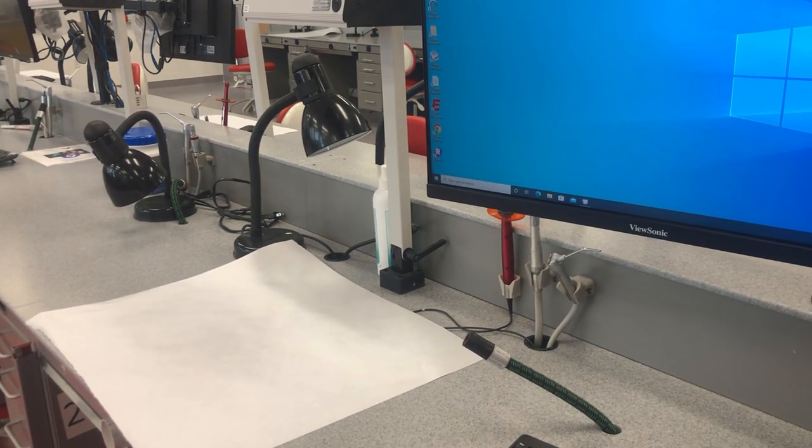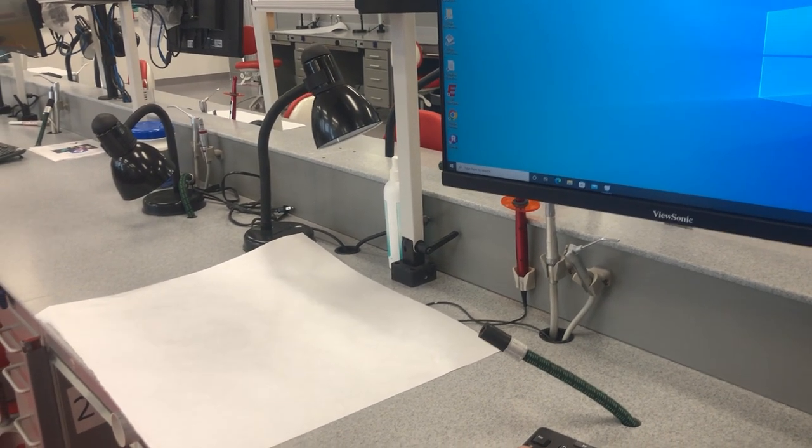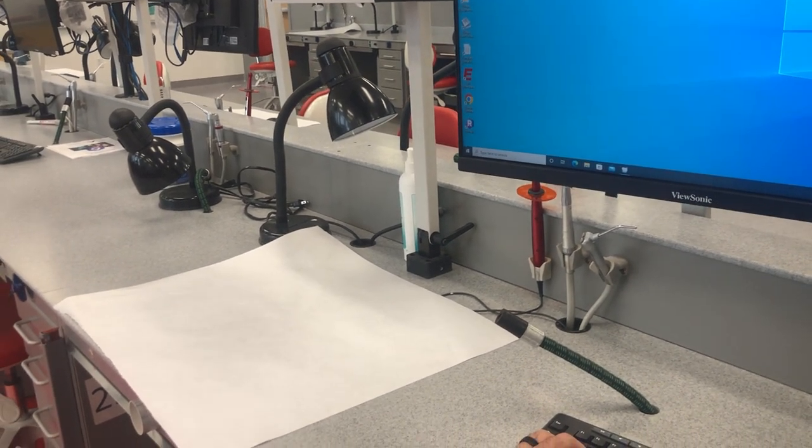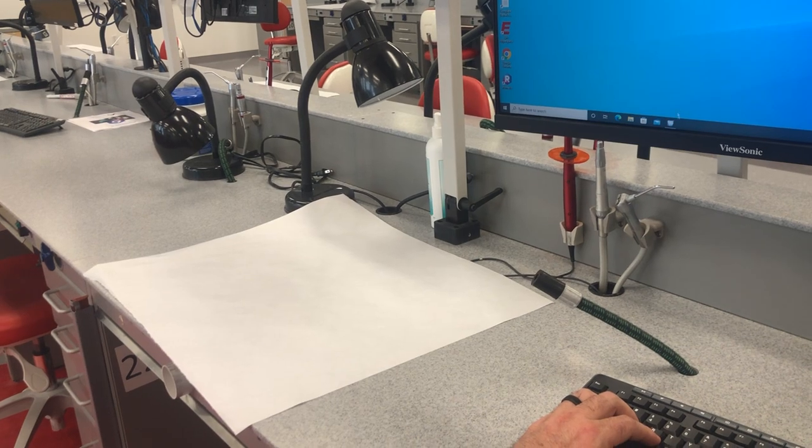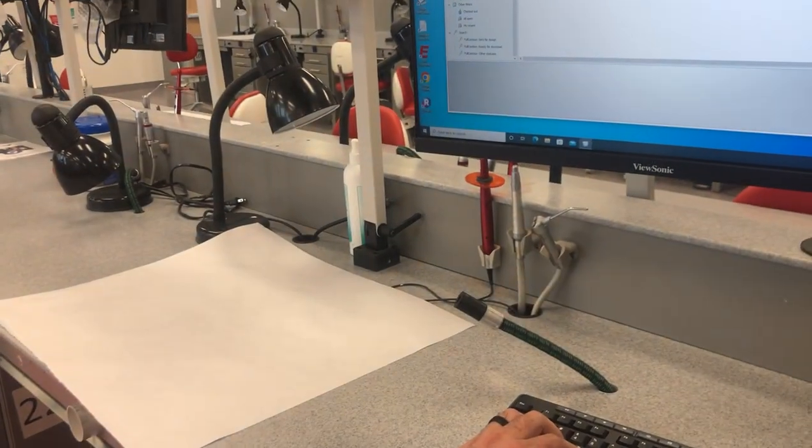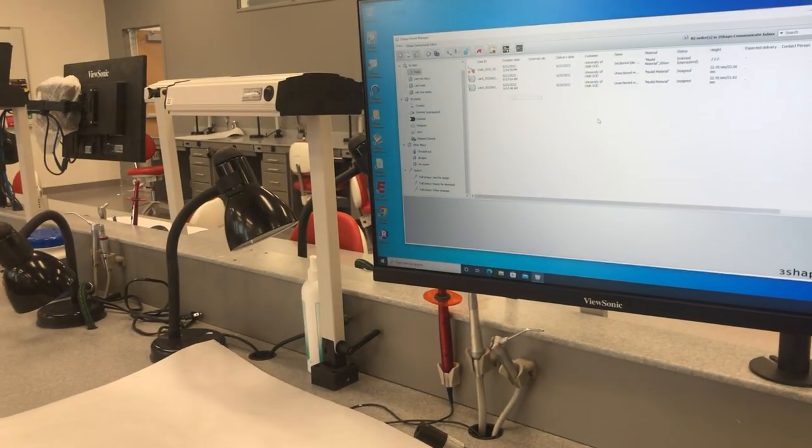You want to click on this icon over here that's got the biggest tooth, not the medium tooth but the big tooth, and then this is the system that comes up.